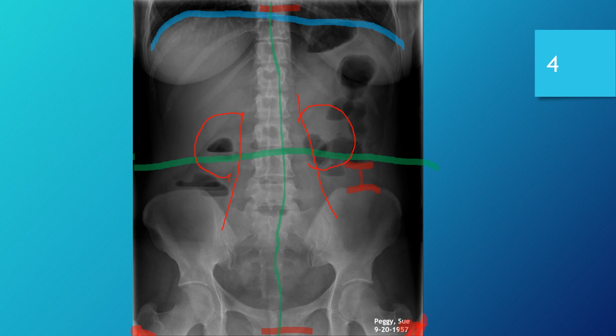Let's see. There we go. And then there. Okay. Let me move that cursor. If you look in those corners there, those are the corners I wanted to show you, you can see what appears to be the shadow of what's probably the patient's hands.